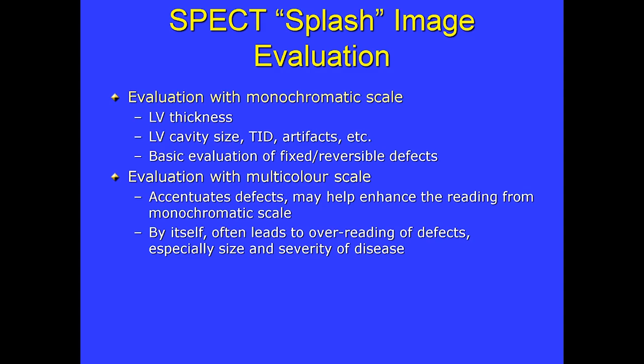Now, the issue is that many people become familiar with one color scale and go with that, which is a very good idea. That's what you really should do, is get familiar with the scale and try to stick to it. But that being said, it is also recommended in the splash images that you should be familiar with at least one monochromatic, one multicolor scale, as being able to look at both may actually help enhance the accuracy of your read.